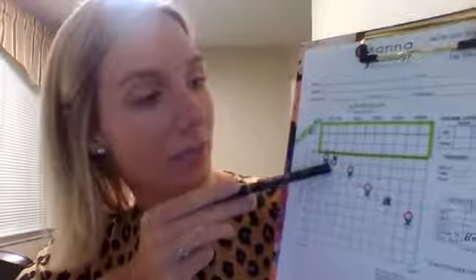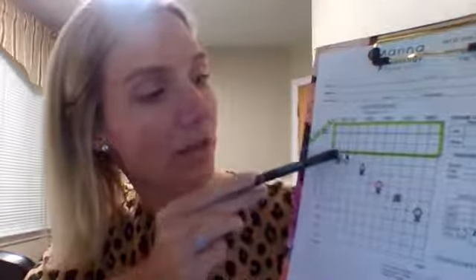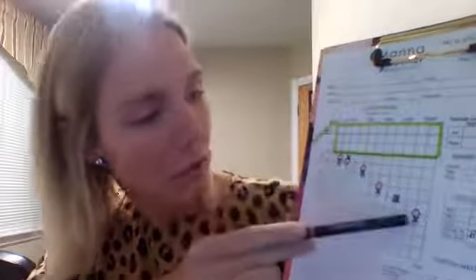So on this side of the chart, you have your low pitches or your low frequencies. So in this example, the person's low pitch hearing is a little bit better than their high pitch hearing. So the low pitches are in the mild range. The higher pitches are down in the moderate to severe range, okay?